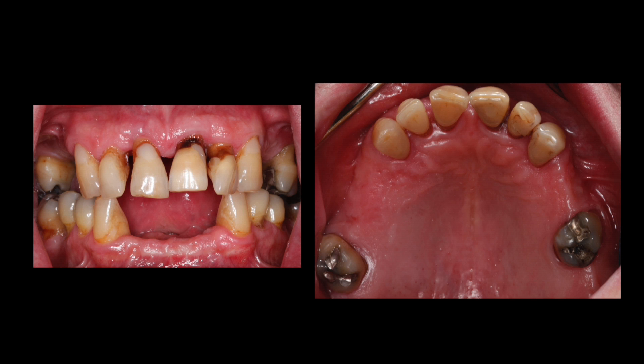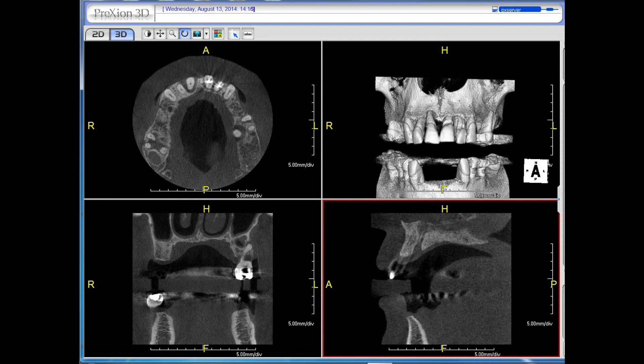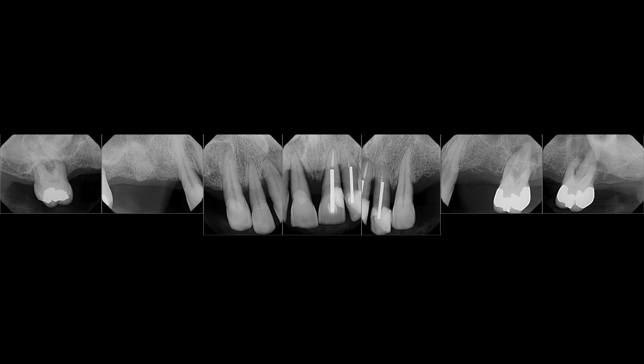What I want to focus on in this video is treatment of the maxillary arch in terms of extraction and implant placement, as well as guided surgery. As you can see, with progressive bone loss — along with the help of a cone beam CT scan — I was able to diagnose the patient in terms of his bone quality and quantity and what we can do with implant therapy.